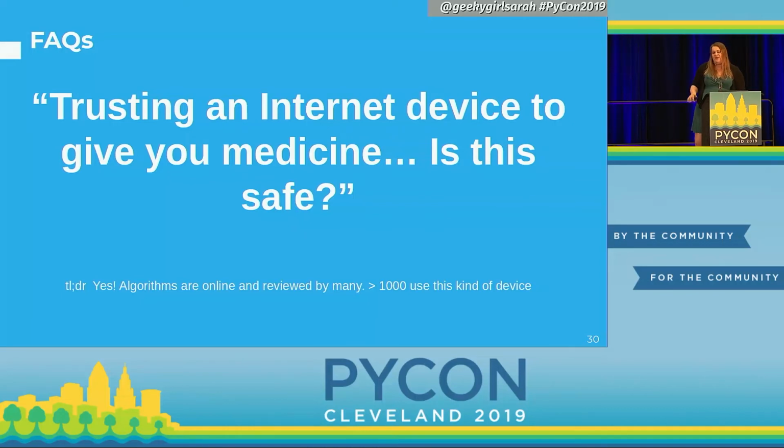Everything is published online, including her research in researchy format, and you can see everything on GitHub and understand the process of the algorithms. And also there's hard limits. So I said in there, you cannot give me more than so much insulin at any given hour. So it will never go above that. And if it tries to, it shuts off the whole system.